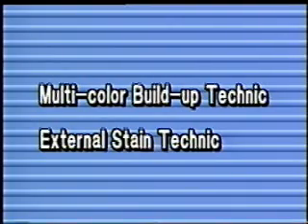To reflect the complicated color shades of a natural dentition, the multicolor buildup technique is to insert the modifier between body and enamel. But this method is so difficult that it requires many years of experience by dental technicians. Of course, there are other easy methods of applying external stain, but they lack the reflection of a permeable color shade.